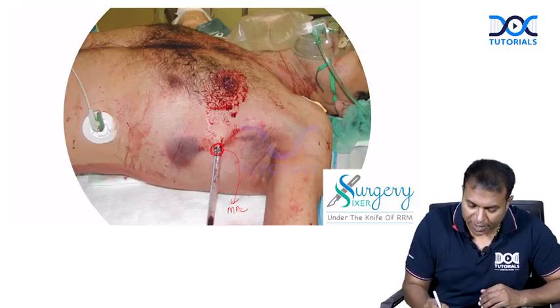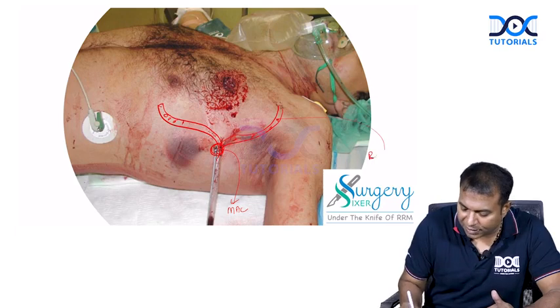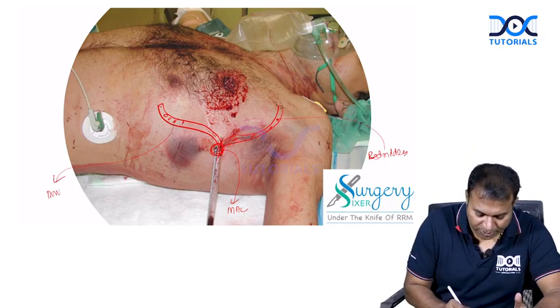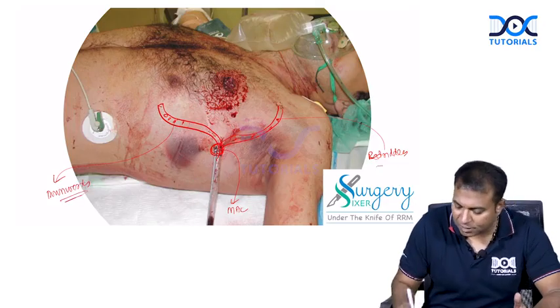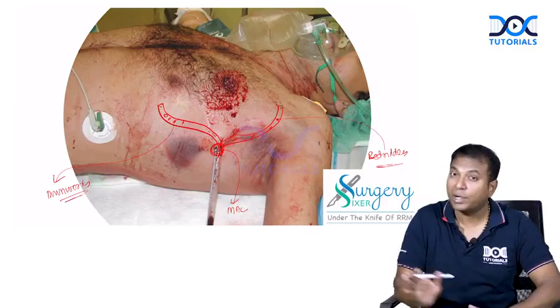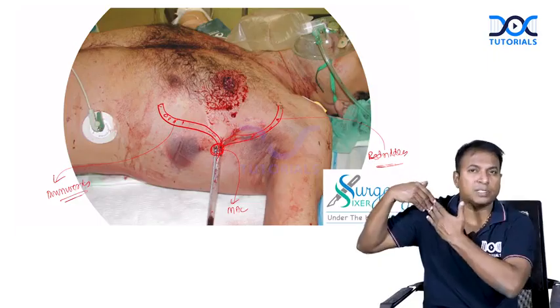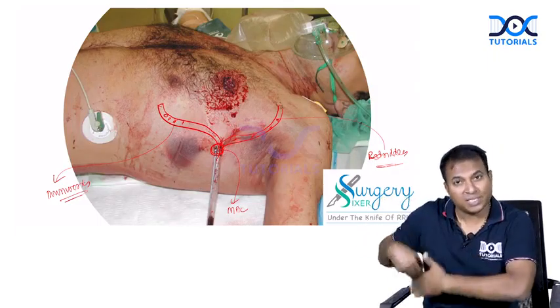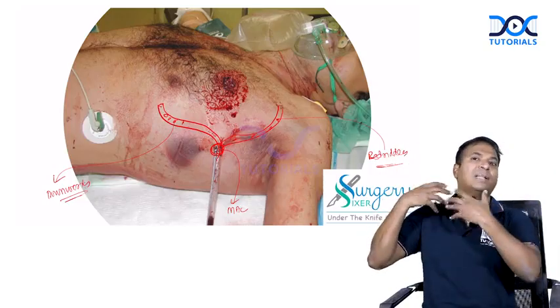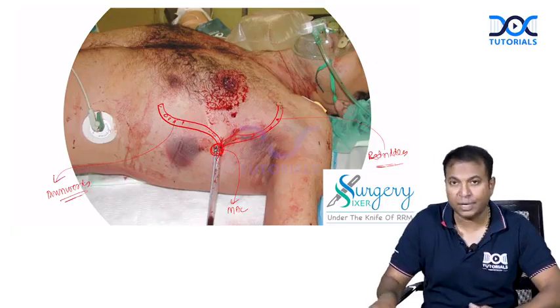I have now put it in this bedridden patient, so I will be pointing it upwards. Bedridden cases, it will be pointed towards upwards. In normal, stable patients, we will point it downwards. But Bailey says in a hemothorax, it is pointed towards upwards because Bailey discusses trauma patients. So we are going to put it upwards in hemothorax. So finally, pneumothorax, point the tip towards apex. Pleural effusion, point it towards down. Bailey says hemothorax also point it towards up because when the patient is lying down, it will get collected here, so it will come out. But most of the time, as surgeons, we will put it downwards only, except pneumothorax.